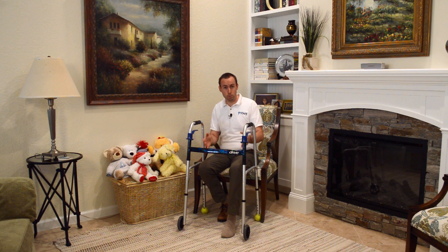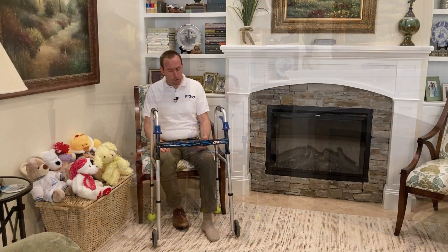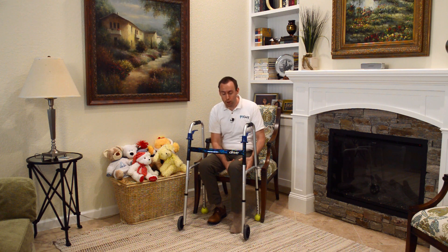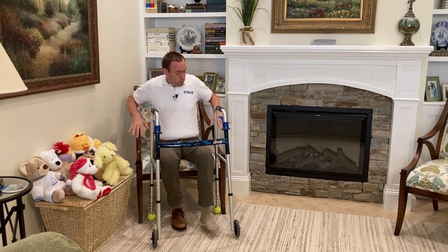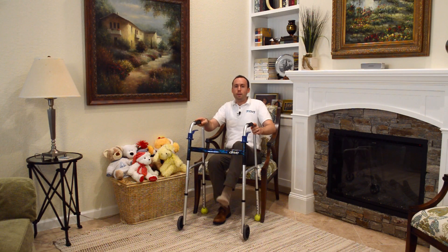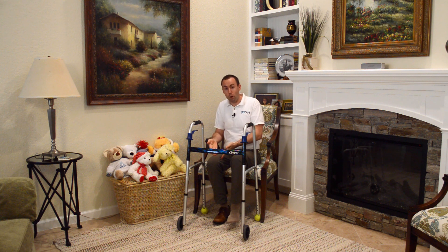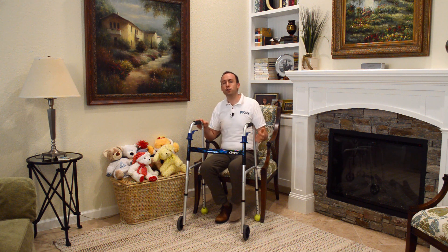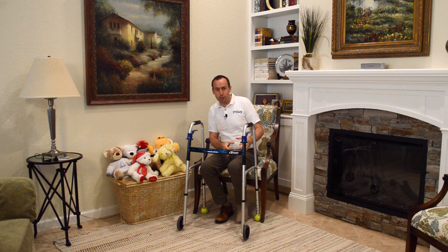Now that we understand the common problem and the principles, let's go over what to do and what the technique looks like. That pyramid is great if you can put all the weight down on your leg, but what if your leg is weak, or you're not allowed to put all your weight through it, or maybe you don't even have that leg at all? If you try to stand up with both hands on the chair, you'll come right back down because you only have that one pillar to stand on.